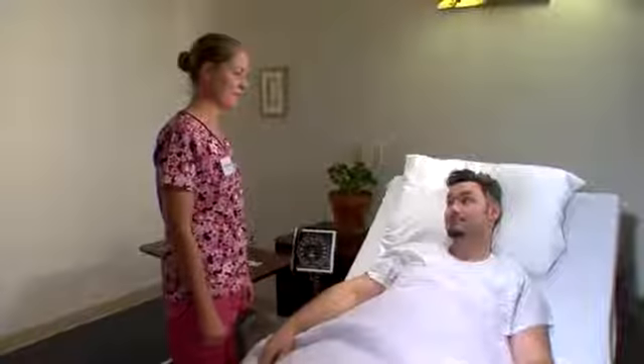Hi Quinn, it's Patricia, your CNA. I'm here to take your blood pressure. I'm just going to clean off the stethoscope before we take your blood pressure.